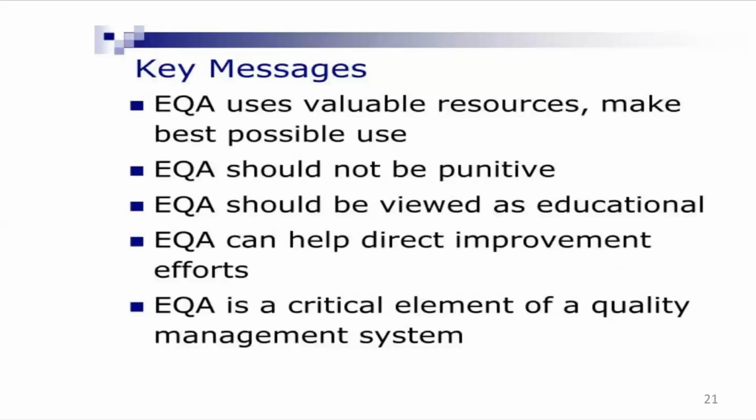See, when you participate in EQAS, you are spending a reasonable amount of money in buying this EQAS. You are using your personnel to run it, your machine, your reagents, so many resources. So it should serve some purpose in your laboratory. It should not be just because otherwise the accreditation body will raise an issue and we have to run this.